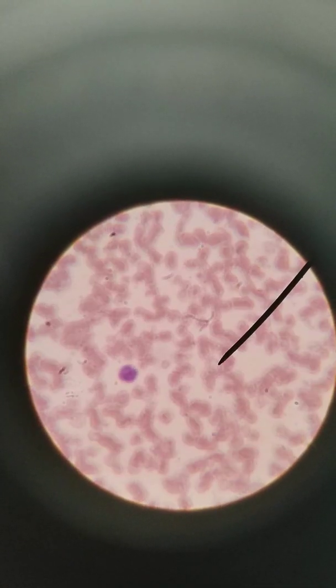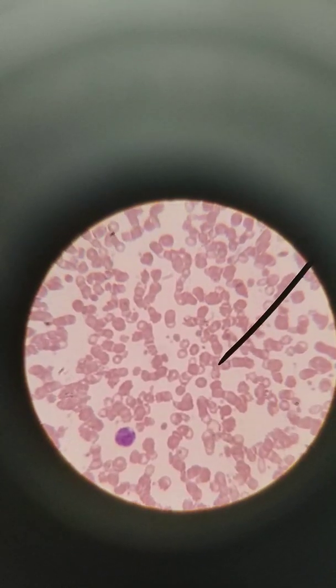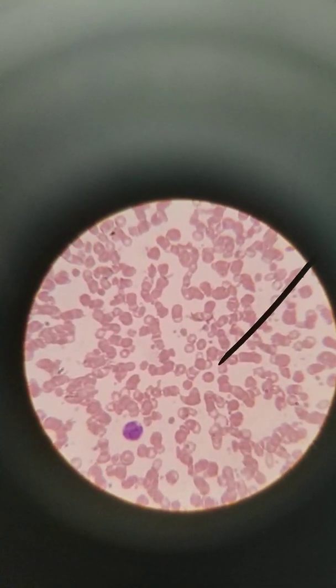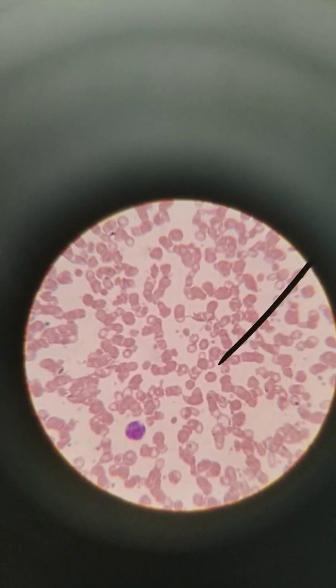One thing that can commonly lead to this is iron deficiency. These ones are especially small, so these are good examples over here. Iron deficiency can lead to microcytic hypochromic anemia. So this is an example of that.